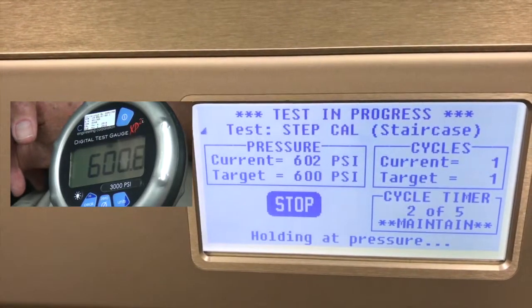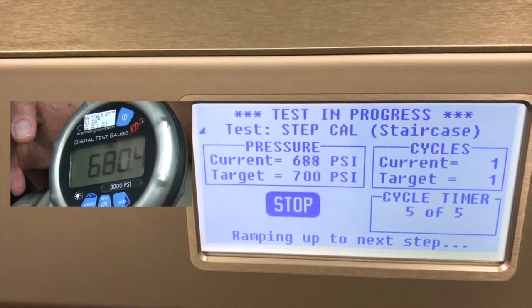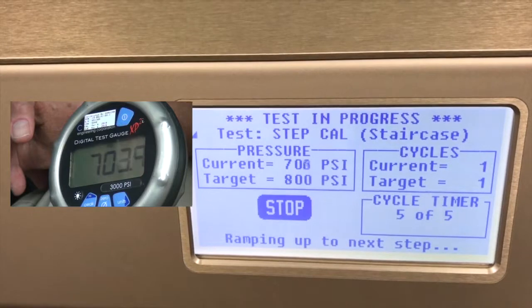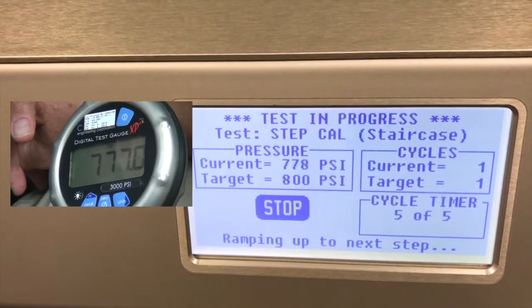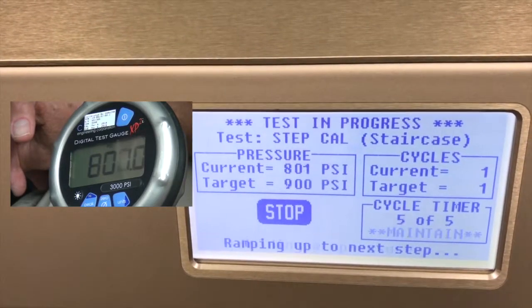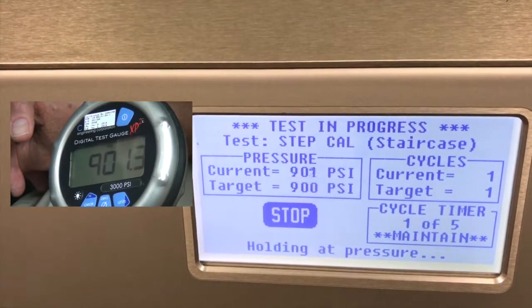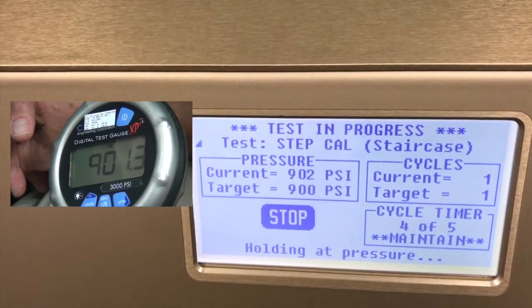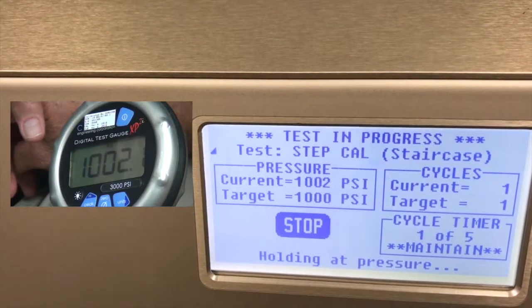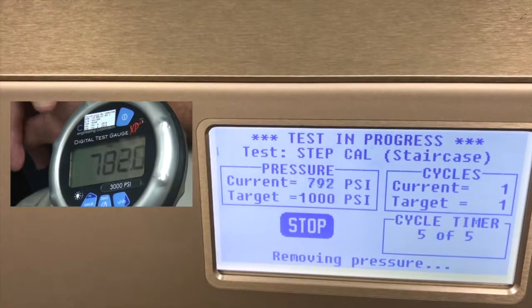Continuing the step test — at 600 PSI: HBLT reads 602, external reads 600.8. At 700: HBLT reads 701, external reads 700.3. At 800: HBLT reads 801, external reads 800.7. At 900: HBLT reads 901, external reads 901.2 to 901.7. Our last target is 1000 PSI: HBLT reads 1002, external reads 1002.1. All readings are within the plus or minus 4 PSI tolerance. Now it returns to 0 and we're done.